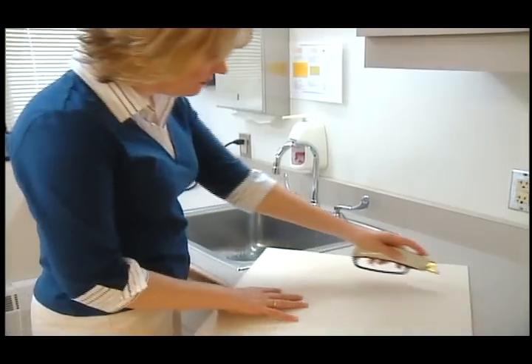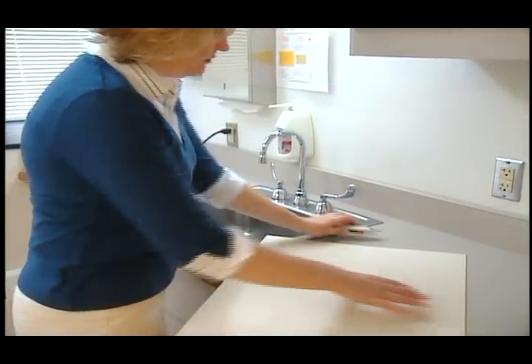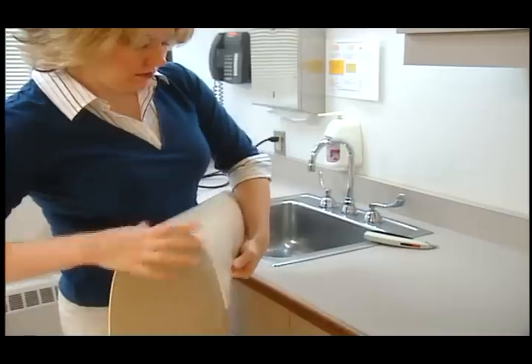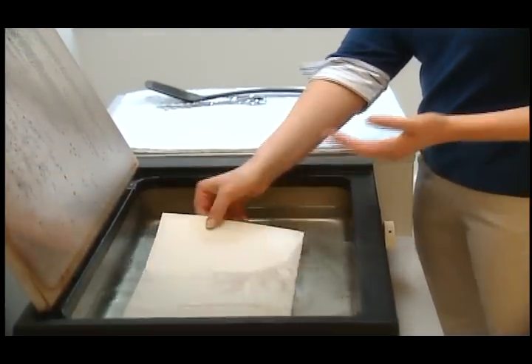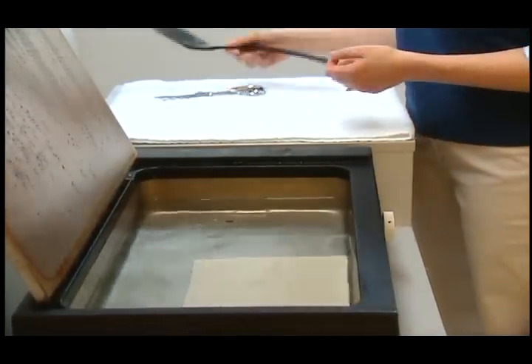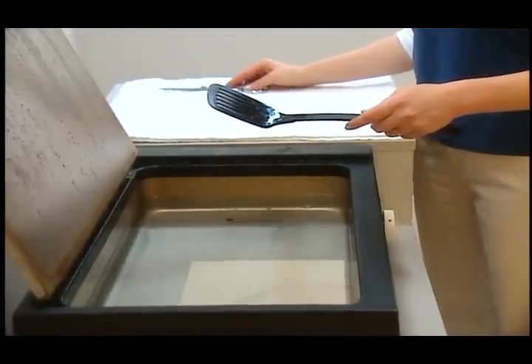The next step is to cut the splint material to size and heat it in preparation for molding. When using a large piece of splinting material, it is best to cut it down to fit your pattern by scoring it with a utility knife, bending it, and scoring it again from the other side. Next, heat the splinting material by placing it in hot water until it is soft and easily moldable. This usually takes only a minute or two.